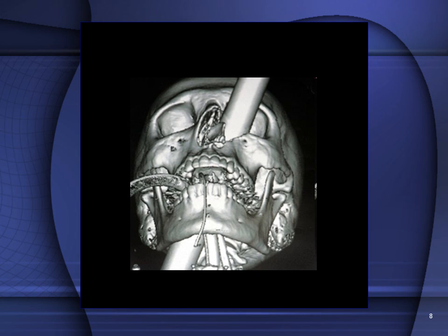This is an interesting film. It is a 3D reconstruction of a patient's skull, and in this instance the patient was involved in a bar fight, and his opponent took the leg of a bar stool that I'm pointing to here with the use of the laser pointer and shoved it through his jaw, through his face, and out the orbit. This, of course, is the endotracheal tube here, going down the patient's airway, and remarkably, this patient suffered no permanent injury.